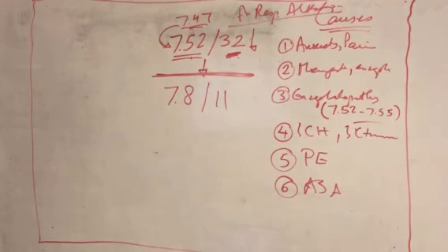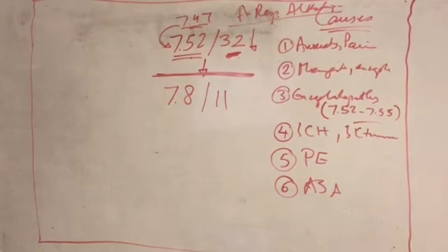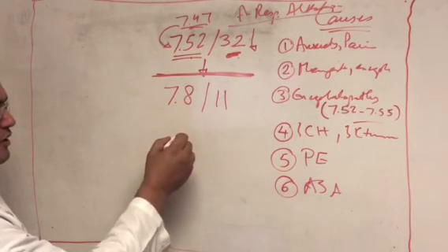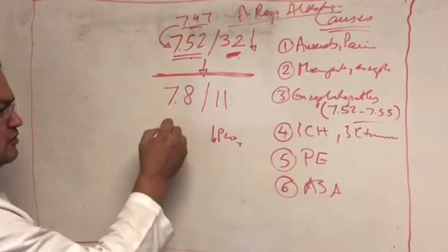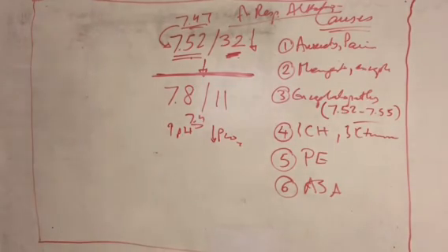Which brings me to a very important concept. You heard the term that you can never overcorrect with the compensation. It's always been said that you can never overcorrect. Meaning, the body won't overshoot. The body is not crazy. So if you have metabolic acidosis, your PCO2 is gonna go down, and your pH is gonna go up, but it will never go up above 7.4, right? That is true if you're drawing the gas from a central line or from an A-line. If you're drawing it in a way where you injure and hurt the patient, you might overcorrect. So you have to accept it.